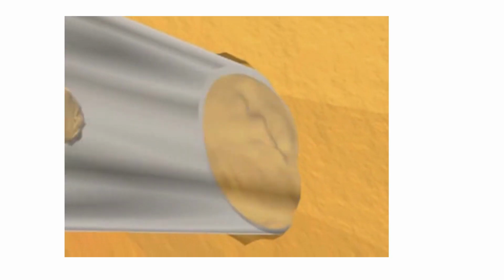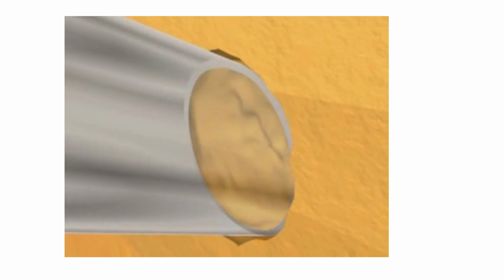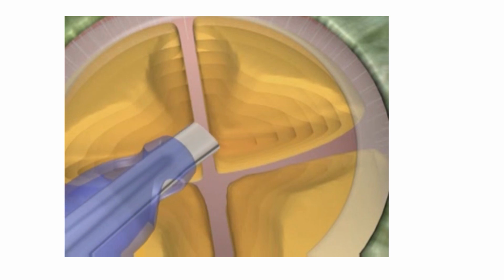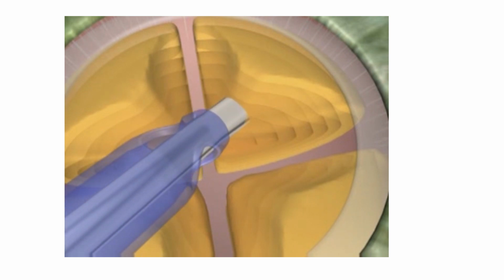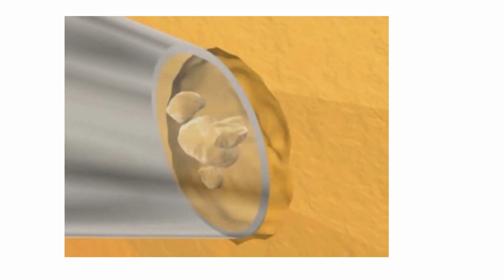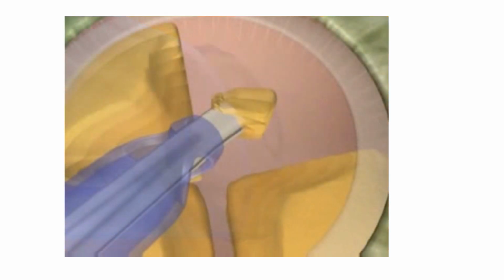Increasing the phaco power will cut the nucleus more, but it will severely raise the thermal or heat energy near the incision site, and also it can create turbulence. So that basically defeats phaco's second and third principle that I covered in part 1. Add to this, the more the power used, the more the chances of repulsion of the nucleus pieces from the phaco tip.